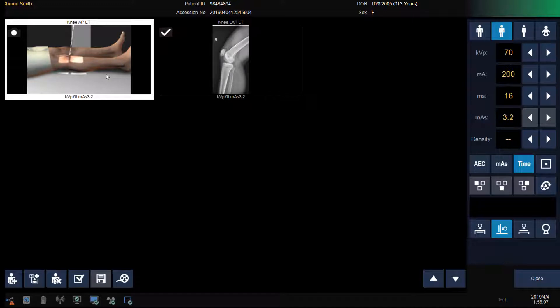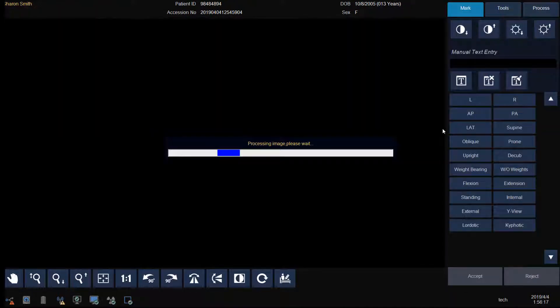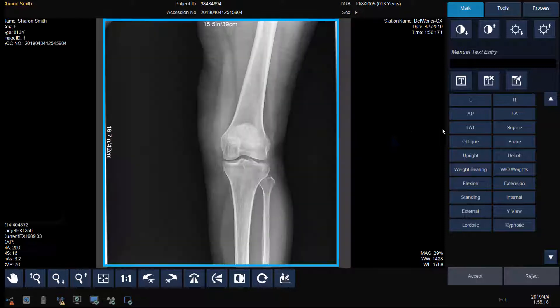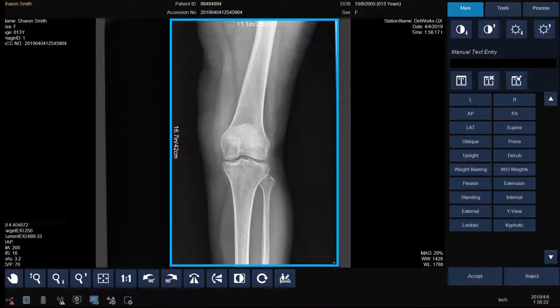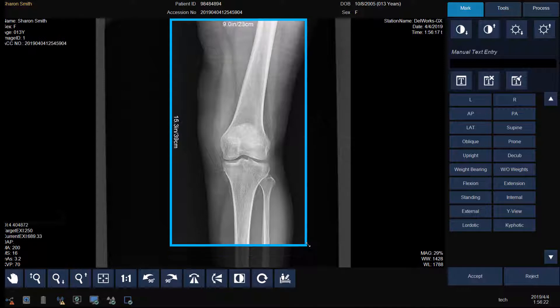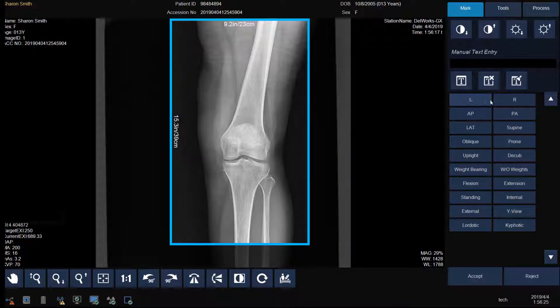Select your next view and repeat the steps. Select your workstation and modify your technique. Position your patient and make your exposure. Adjust your shutter by adjusting the blue bar. Add a text annotation and click Accept.